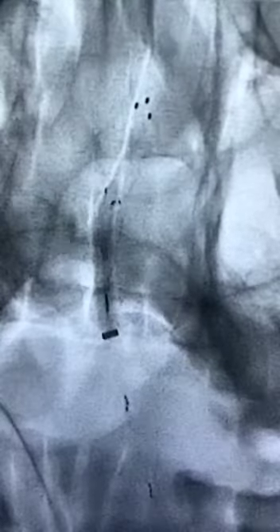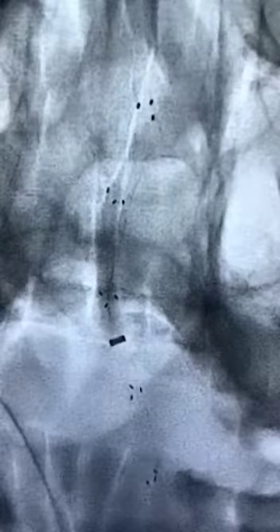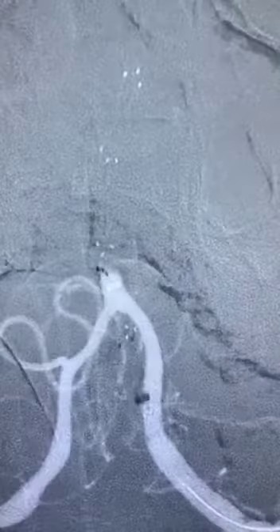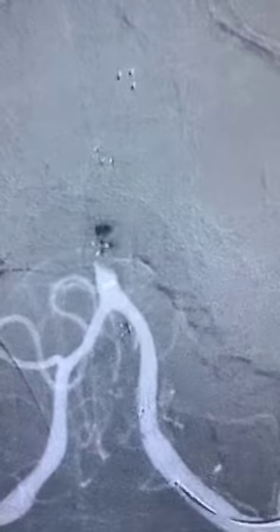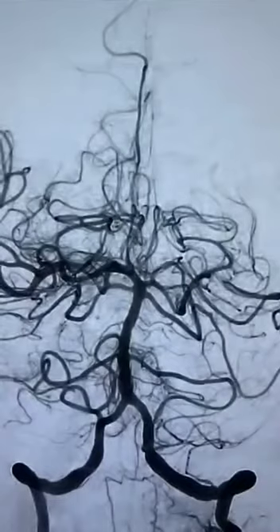Following that, the stent retriever is deployed and the microcatheter removed. The aspiration catheter is further navigated to wedge against the clot and the whole system is removed. There was complete TICI 3 reperfusion and the patient did extremely well.